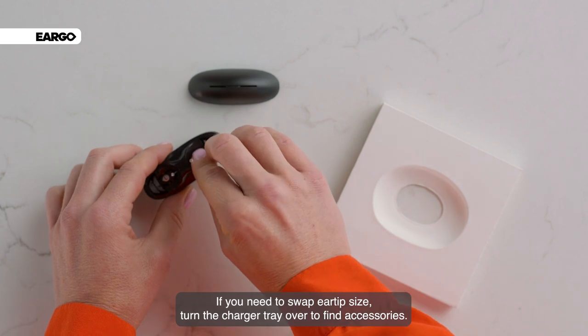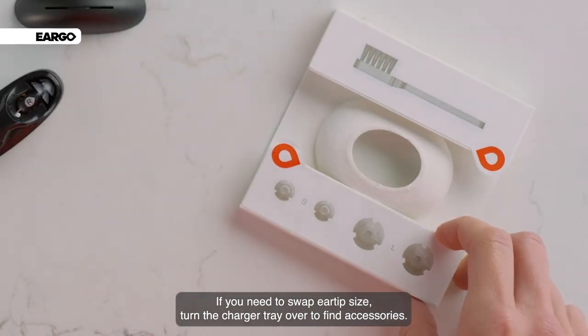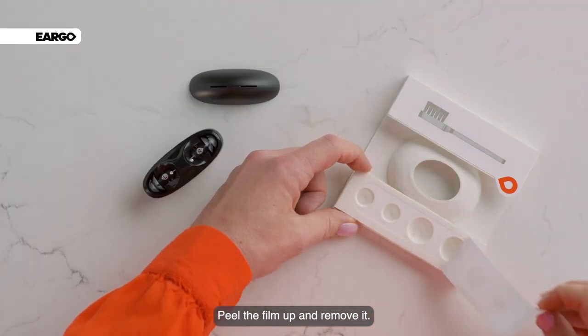If you need to swap ear tip size, turn the charger tray over to find accessories. Peel the film up and remove it.